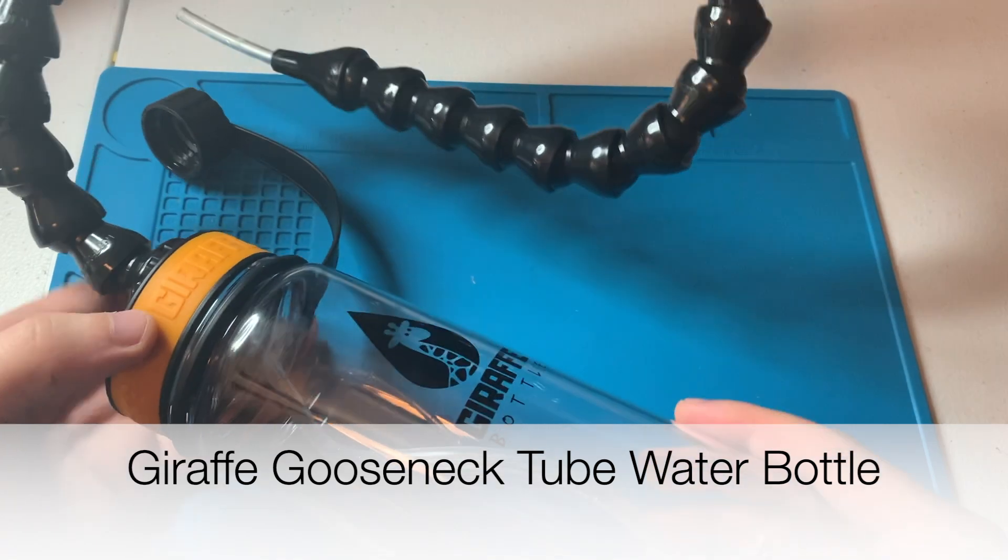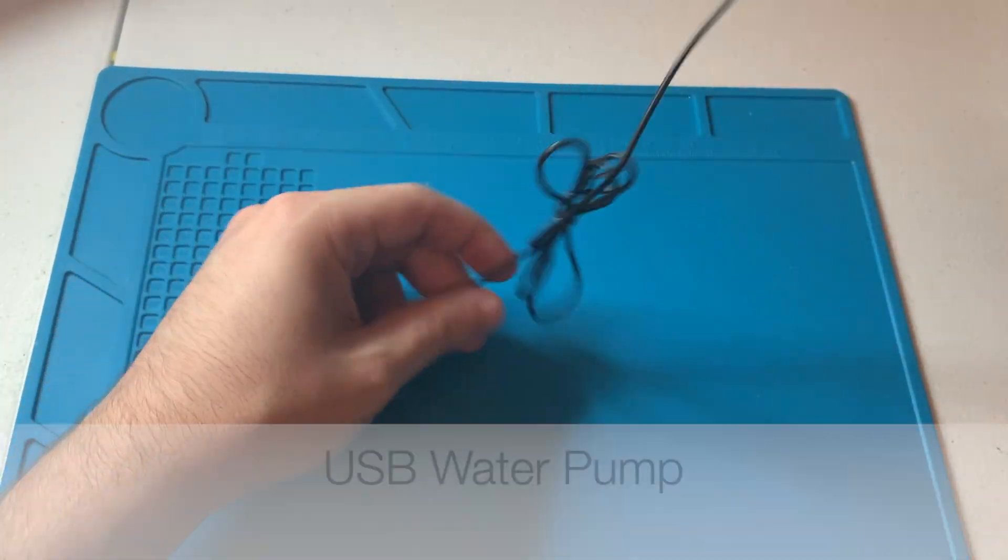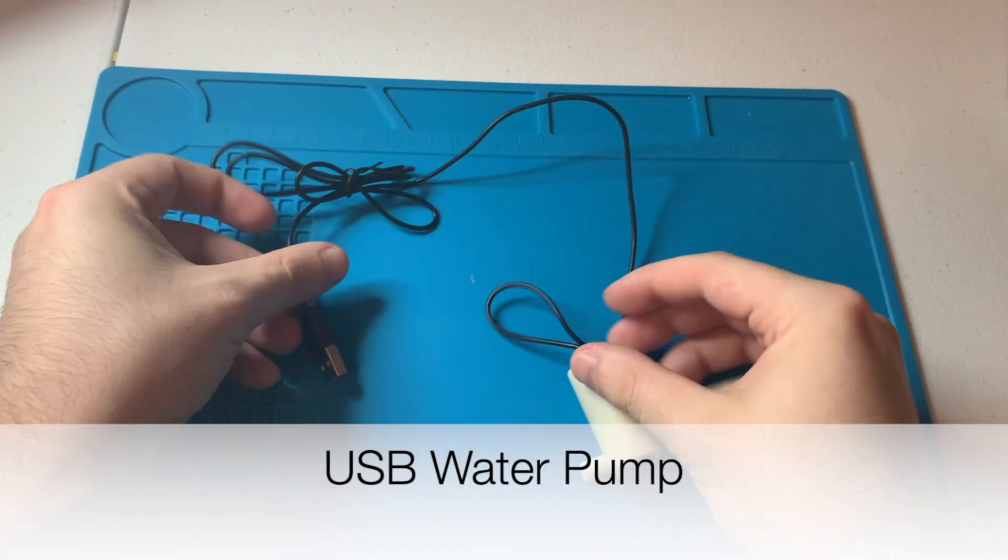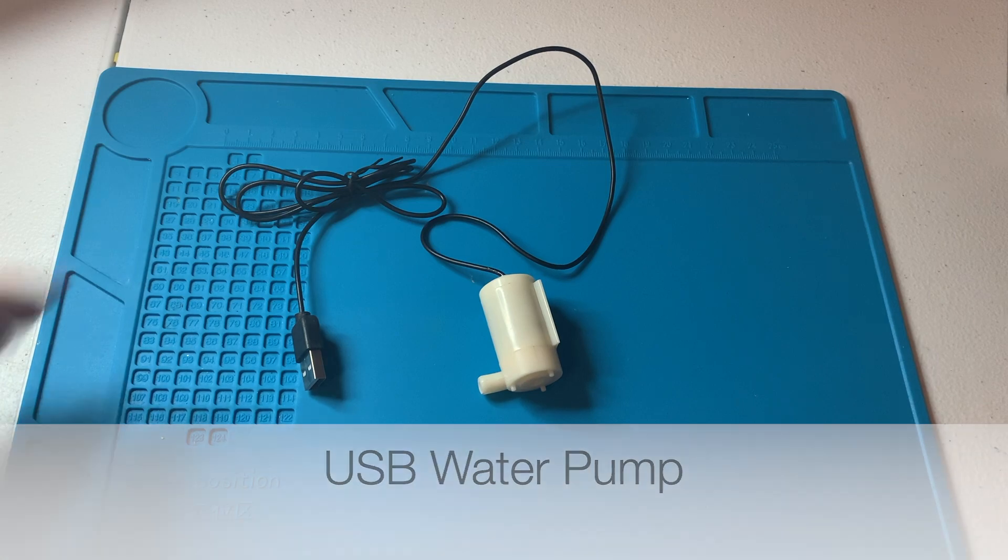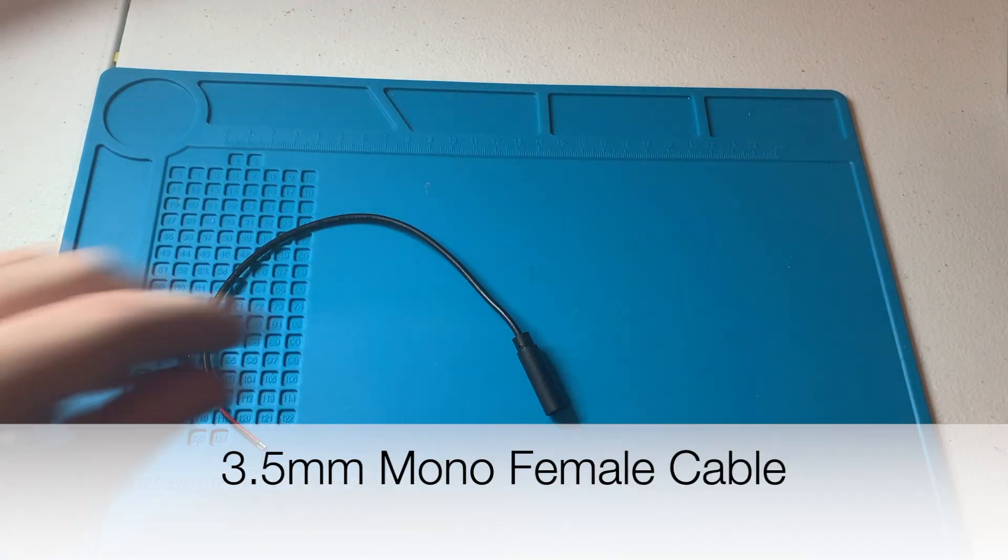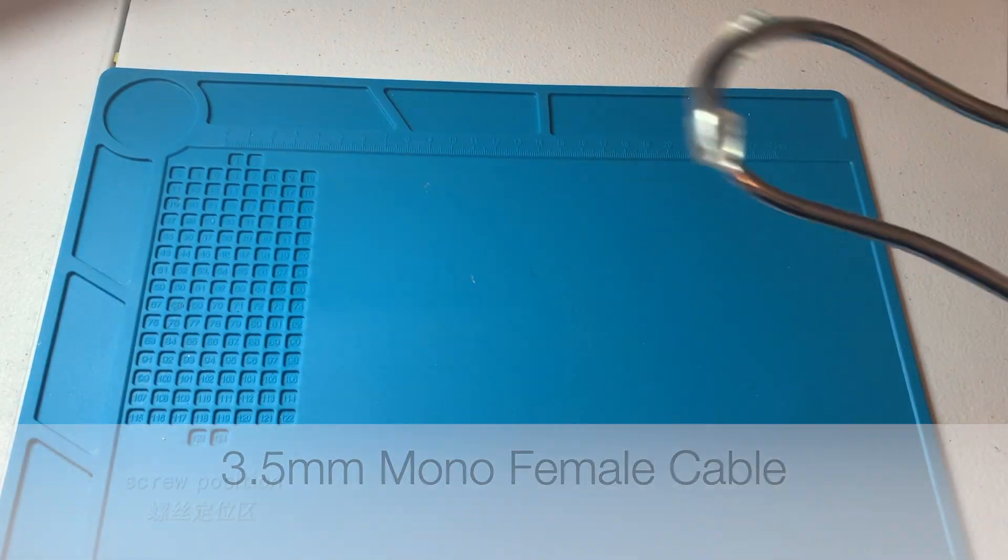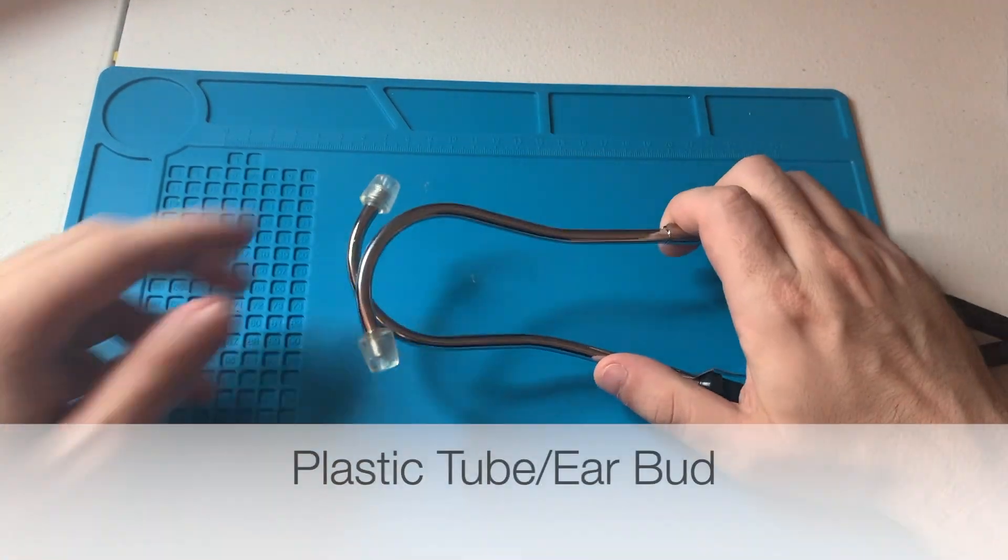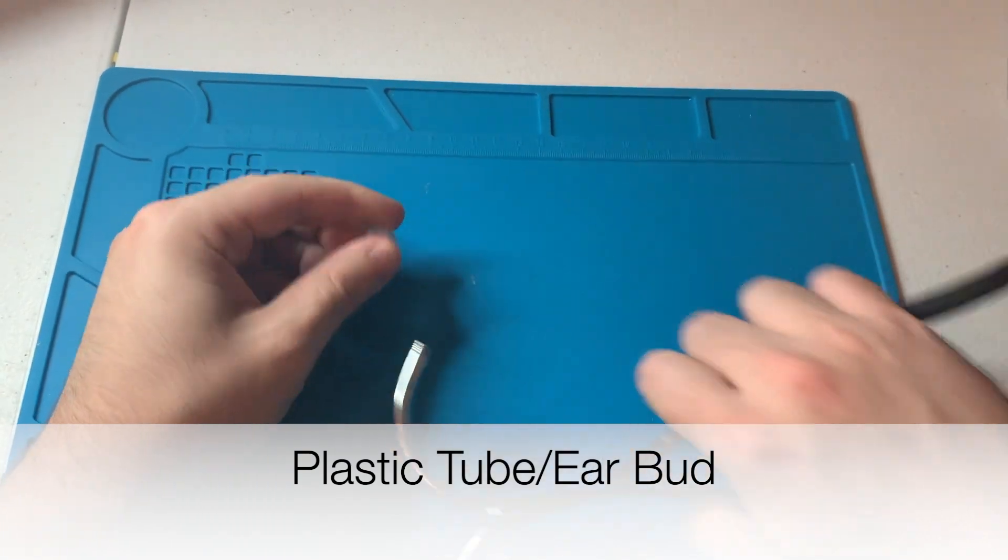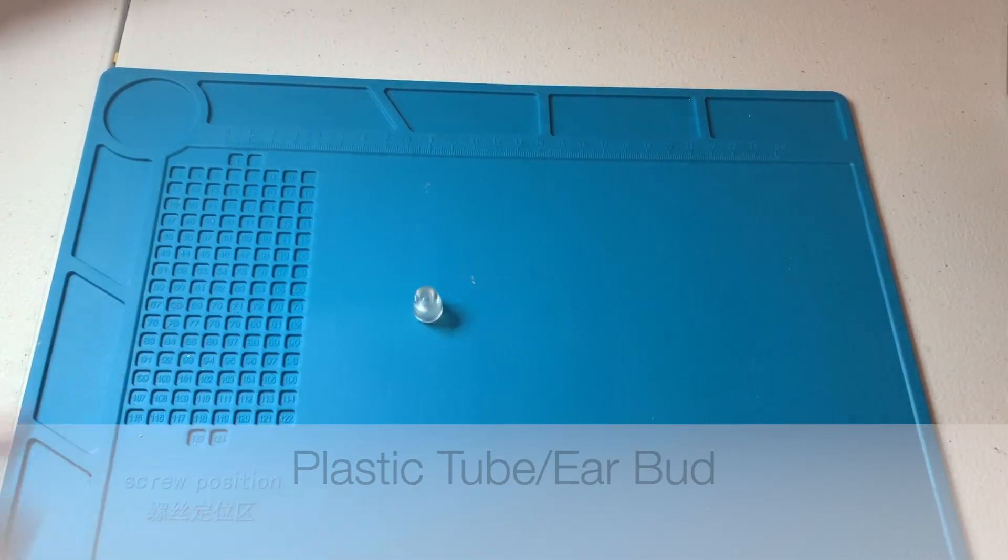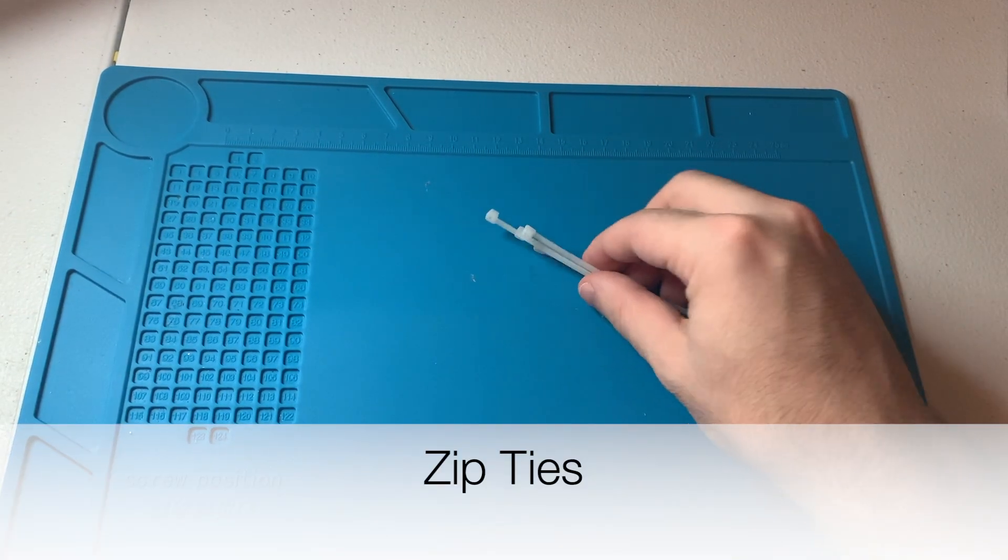You're going to need one of these giraffe gooseneck tube water bottles, one of these water pumps, a switch adapter, and I'm using this plastic earbud that comes on stethoscopes, but you can find alternatives, and a couple of zip ties.